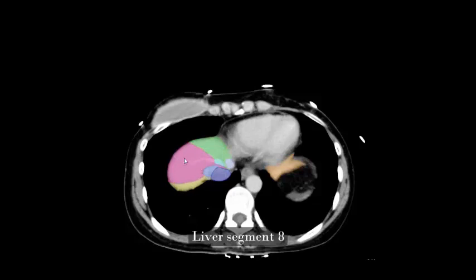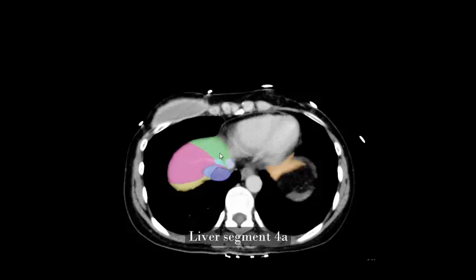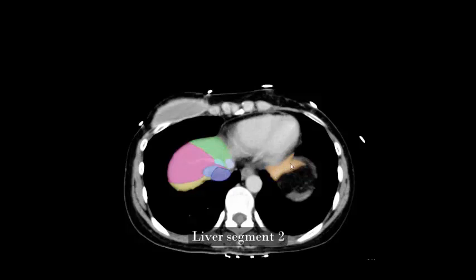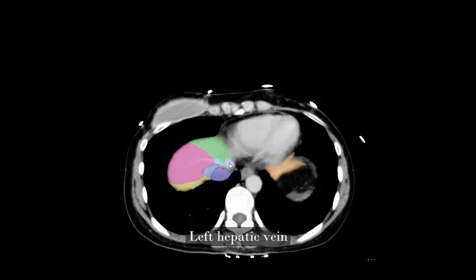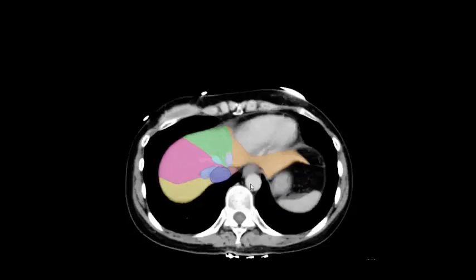Liver segment 8, liver segment 4a, liver segment 2, inferior vena cava, right hepatic vein, middle hepatic vein, left hepatic vein, liver segment 7.